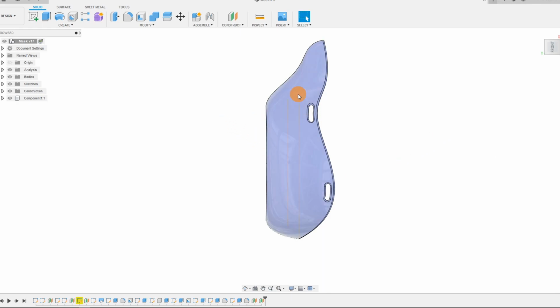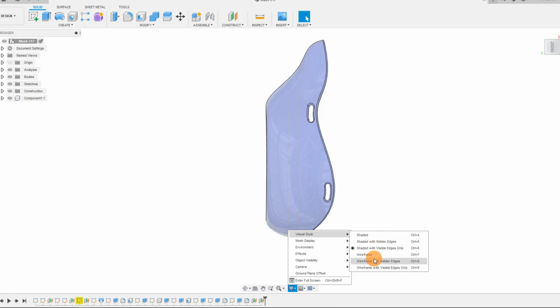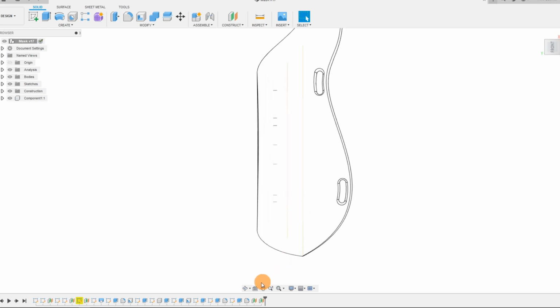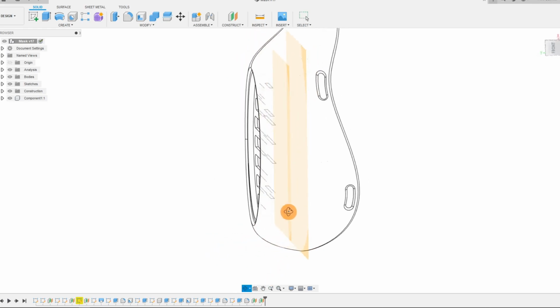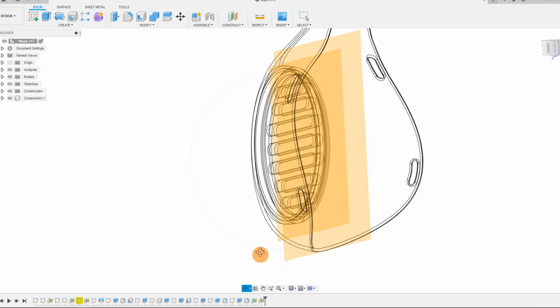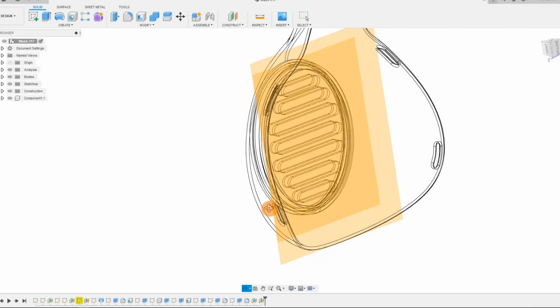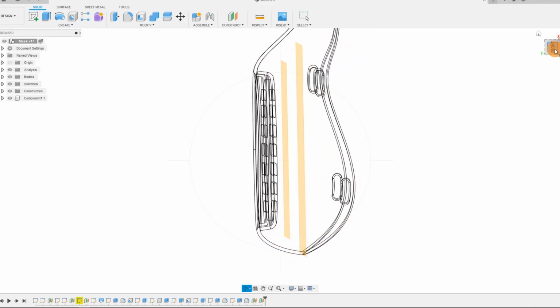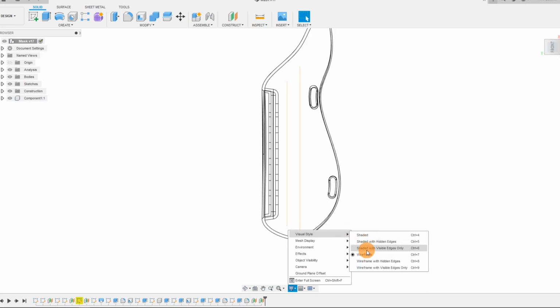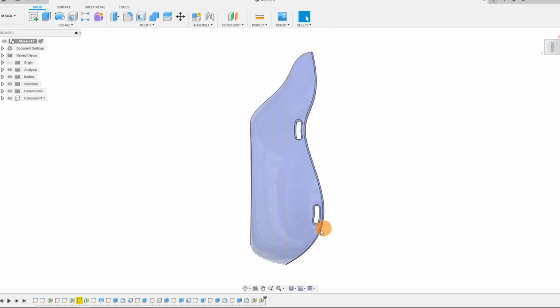And if you're having trouble seeing exactly what you're doing, you can just come to Visual Style and make it wireframe with hidden edges. And now it's a little bit easier to see inside. Can also do just wireframe. That might help us out a little more. So you can see a little bit more where you are in terms of where the filter is and where your planes are. Okay, I'm gonna bring it back to shaded with visible edges.